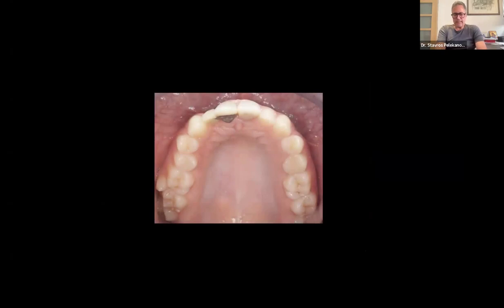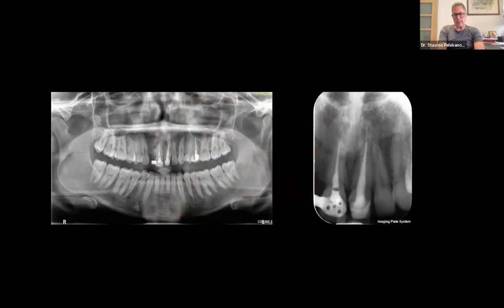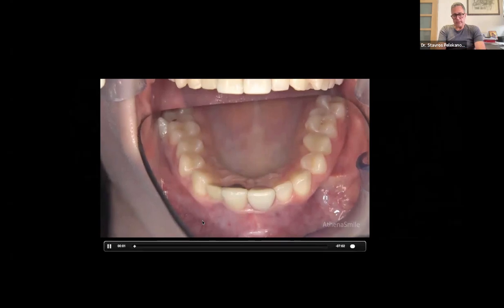So second option, and this is the last case I will show you in terms of single implants. This is a late implant placement. We have here a Maryland bridge on the number 12. So we do the planning. The planning usually we do in the Smile Cloud. And as you can see here, we are always planning the part of the implant which is rough approximately 4.5 to 5 millimeters below the clinical crown. So the planning is done in advance. And now let's go to the surgery.